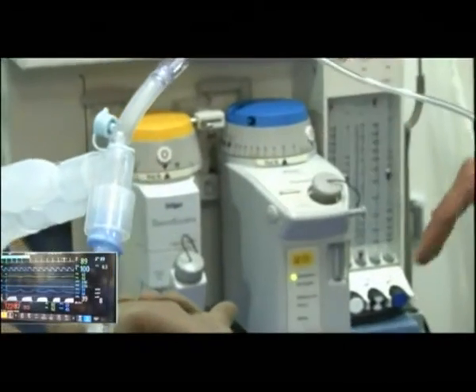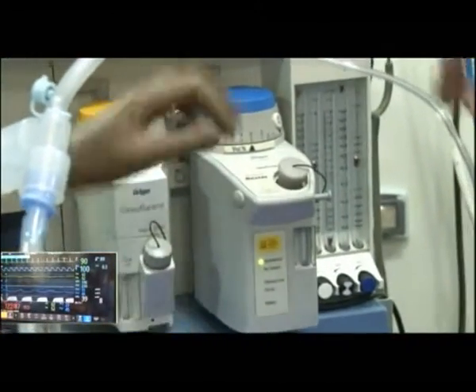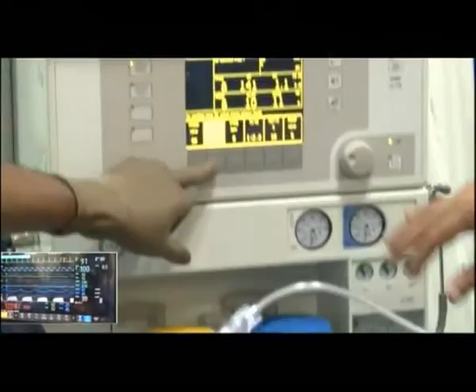And what we are going to do is I also want to show you the end-tidal, what's the MAC value? MAC.